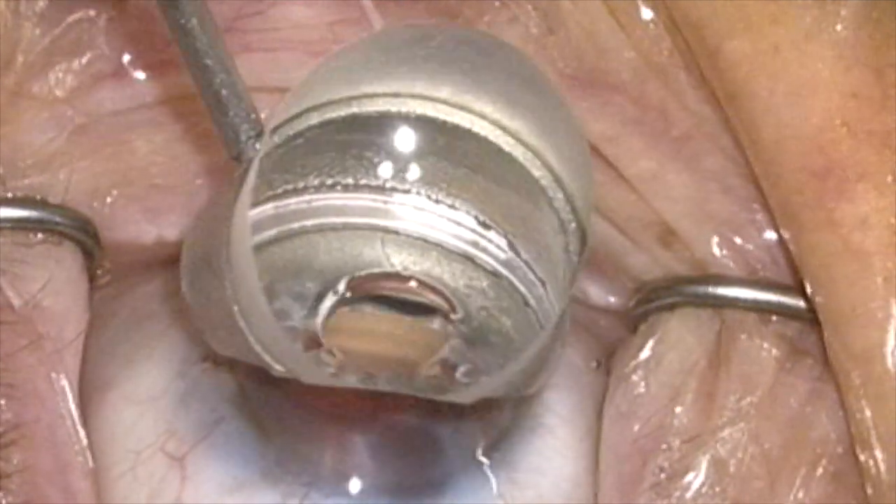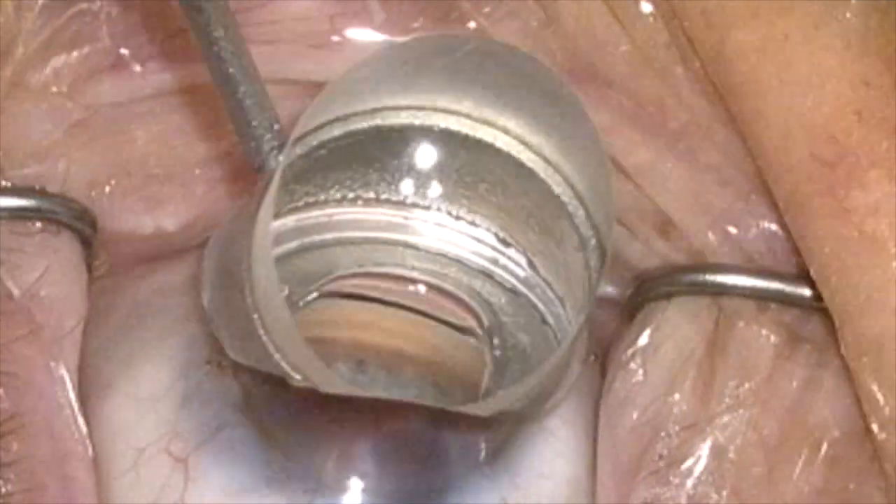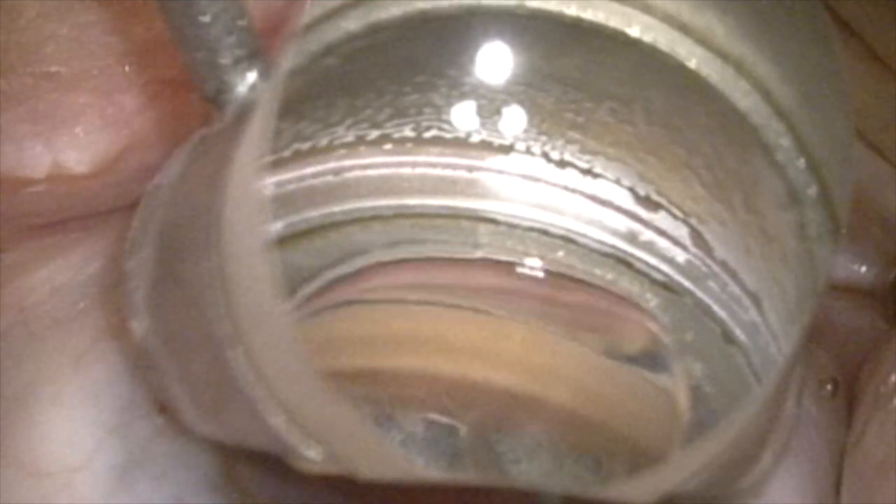This short video will demonstrate placement of an eye stent into Schlemm's canal and then subsequent verification of the proper placement in two patients.